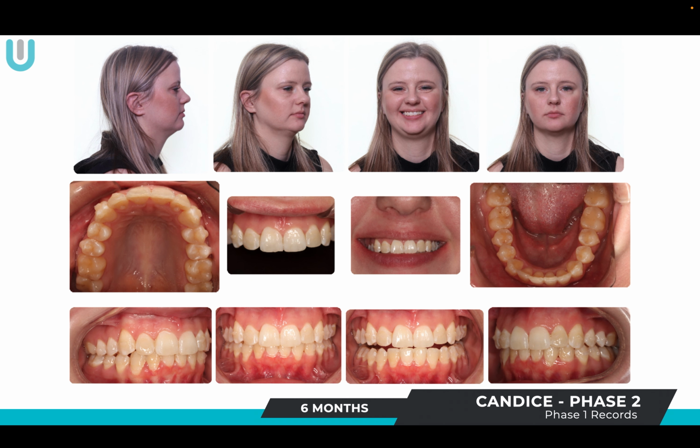Well, this is where when the patient comes in, we're going to go ahead and do a little bit of enamel reshaping, maybe bond an edge if we have to, talk to her about what the goals are, ask her what she's looking for, how much energy she has left to complete the treatment. Usually in the first phase, they're like, hey, I love it. I'm excited. Let's keep going. Do what you do best.